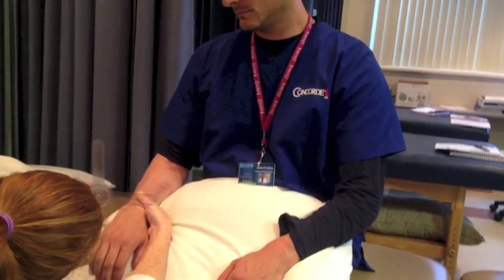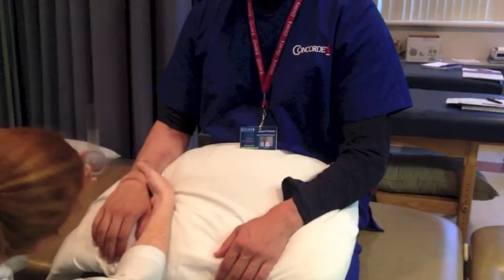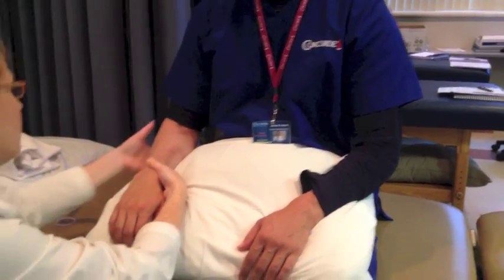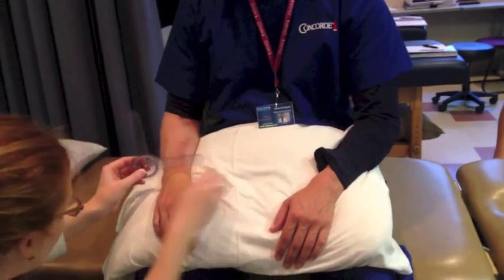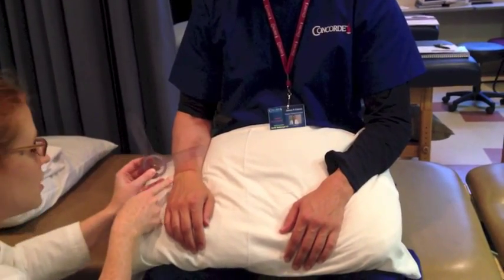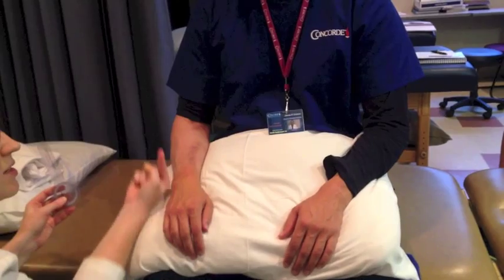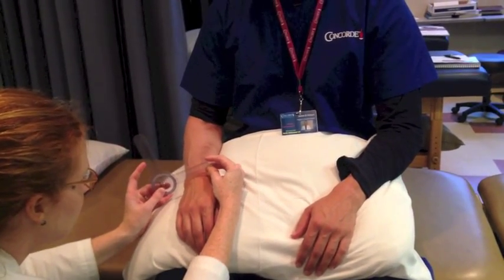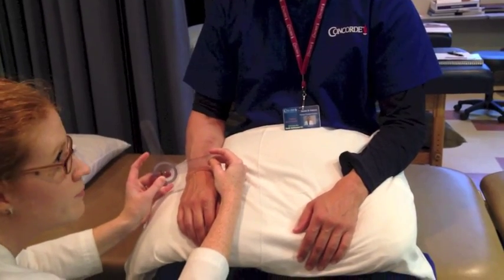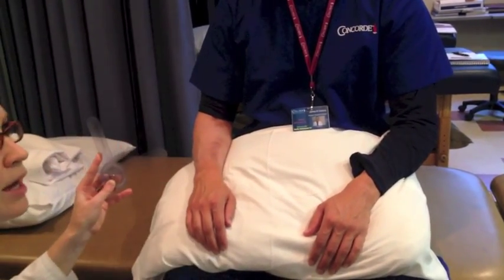We are at 91 degrees. The fulcrum came up a little bit, but I was still in the same plane as the ulnar styloid in an attempt to get this parallel to the dorsum, while still having the stationary arm pointed straight up.